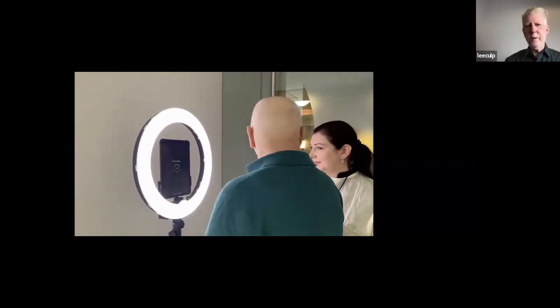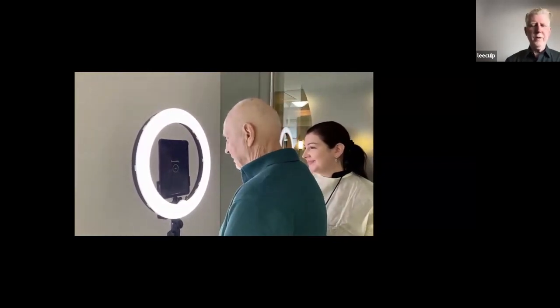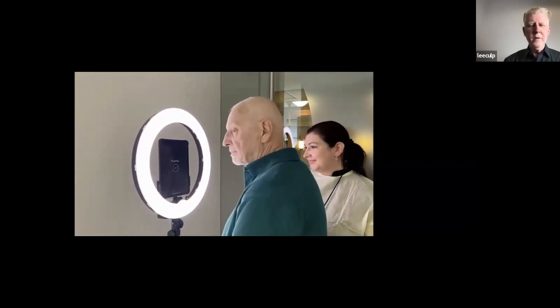And then it's going to render all of those images it just took into a three-dimensional head.